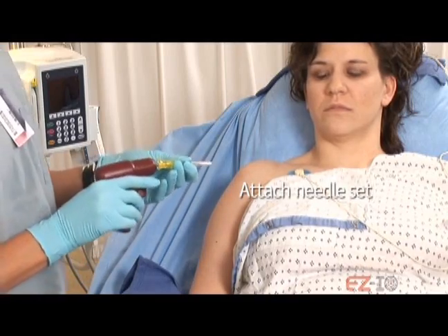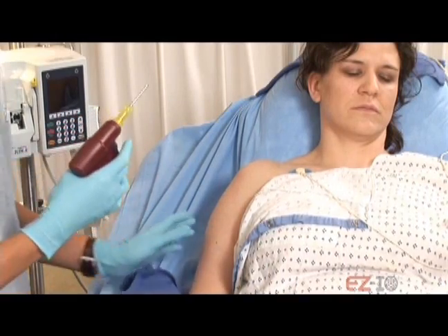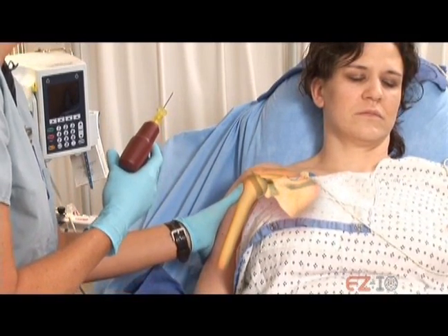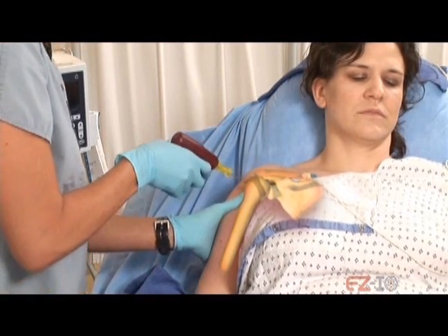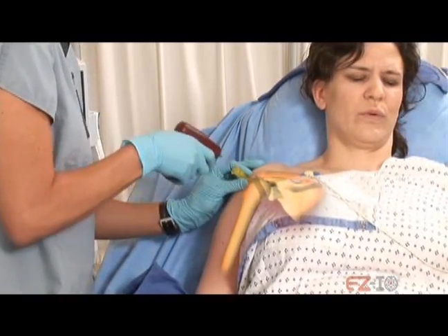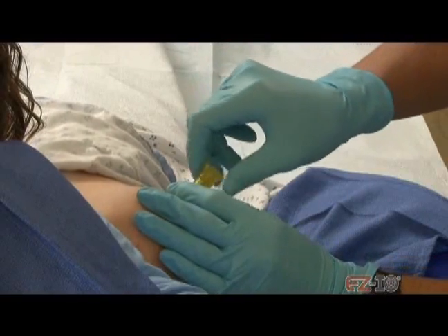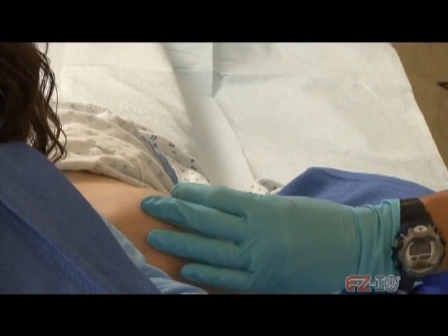Attach the needle set to the power driver and remove the safety cap. Okay, now what I'm doing is just coming up and finding that spot again. Insert the needle until the needle is touching the bone. Verify there is sufficient needle length. Power the driver and advance, applying limited pressure until you feel a change in resistance. Stabilize the needle set hub and remove the power driver. Remove the stylet and dispose of in an approved sharps container.